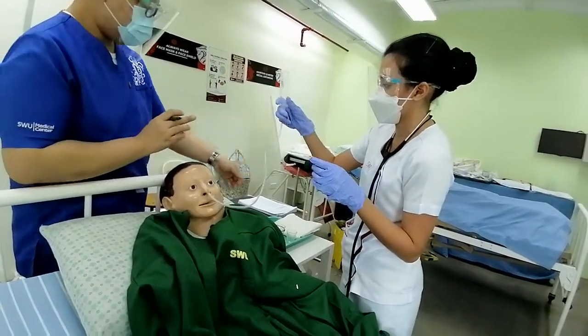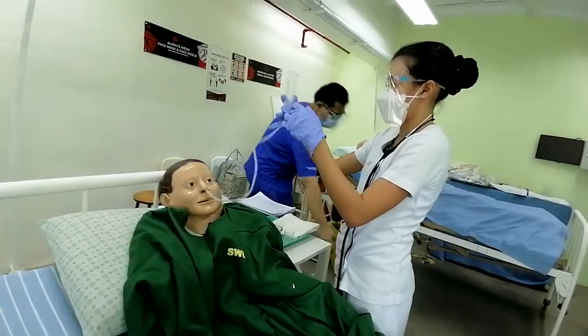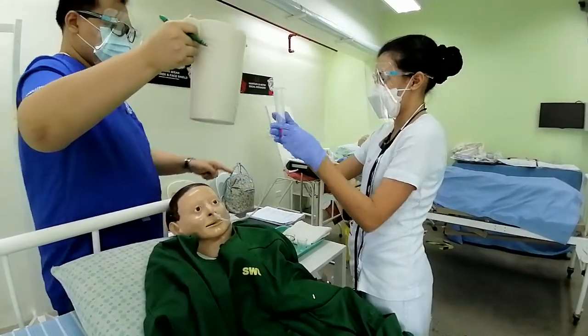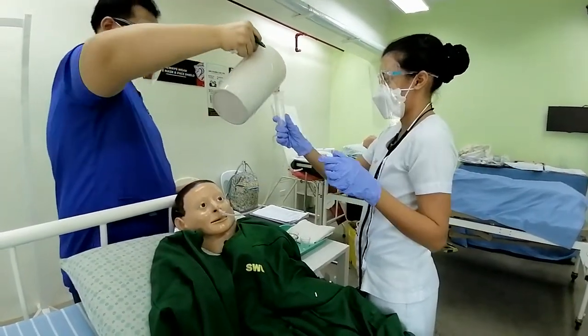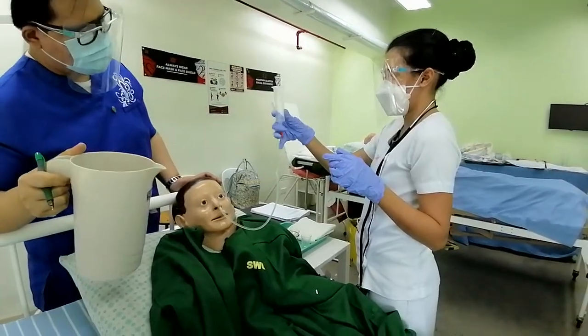Can we try it one more time? Is this your dominant hand? Oh, it's easier. Kink it. Release it. Okay. It's just timing.